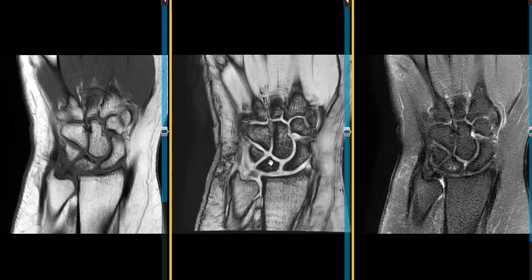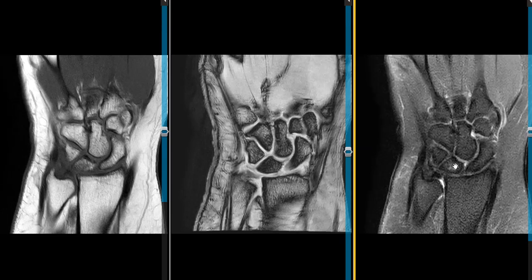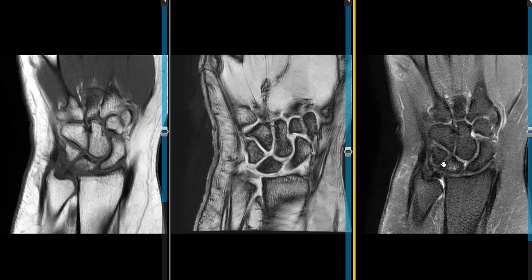In the end we're left with the negative ulnar variance with the compensatory thickening here, and we have some very subtle signal changes within the lunate bone. The patient could have had an impaction injury a couple months ago — just bruised or contused it — and it could look like this. But more likely this is what we call Kienböck's disease, or lunatomalacia, or early avascular necrosis of the lunate bone. This is often associated with a negative ulnar variance, where there's abnormal stress on the lunate bone because the radius puts all the load right on it, and then you can get non-displaced subtle microfractures and disruption of the blood supply, which can progress to avascular necrosis.